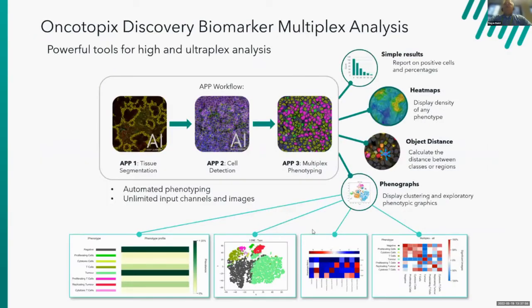And in order to do multiplex analysis, at Visiopharm, we really look at a multiplex as basically several individual stains, several rounds of individual images that are all stacked on top of each other. So everything that we have learned in our domain expertise as cancer biologists, where we're looking primarily at what we call immunohistochemistry images, in a multiplex world, we're just looking at many, many, many of those stacked together. And it doesn't matter if they are staining cells, staining compartments, staining subcellular structures. We see each of those as an individual channel in the image, and so we can analyze them.